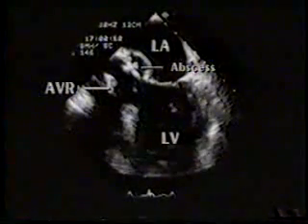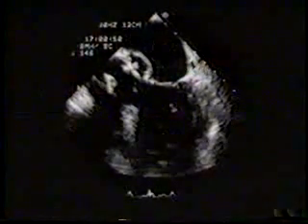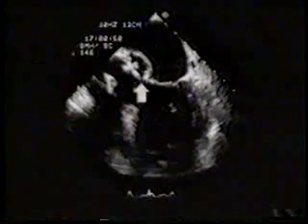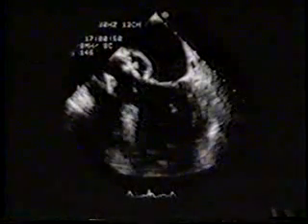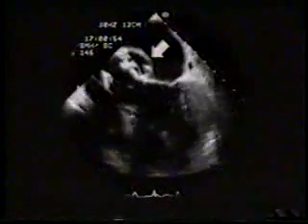This patient developed Listeria endocarditis 1 year after implantation of a Carpentier-Edwards aortic prosthesis. These are the stents of the prosthesis. This is an abscess cavity adjacent to the aortic root. There is debris within the cavity. Communication of the abscess with the left ventricle is apparent here. This is a small vegetation attached to a cusp of the aortic prosthesis. Note the systolic expansion of the abscess cavity.